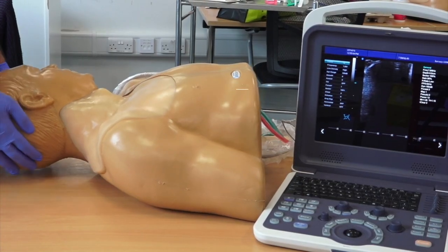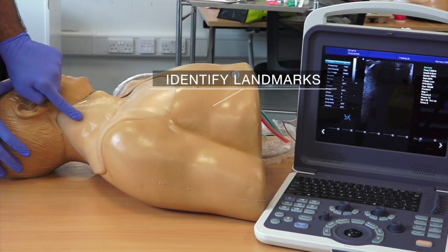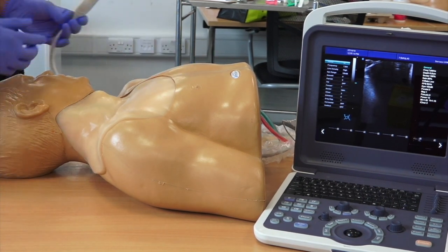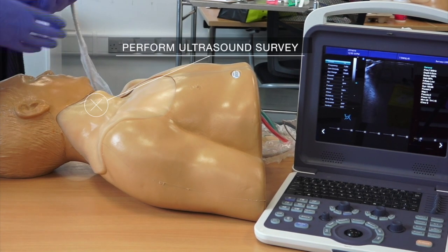Identify the anatomical landmarks. The landmarks are the two heads of the sternocleidomastoid muscle. The landmarks can be accentuated by asking the patient to lift their head off the bed. The target is the apex of the triangle formed by the two heads of the sternocleidomastoid muscle.